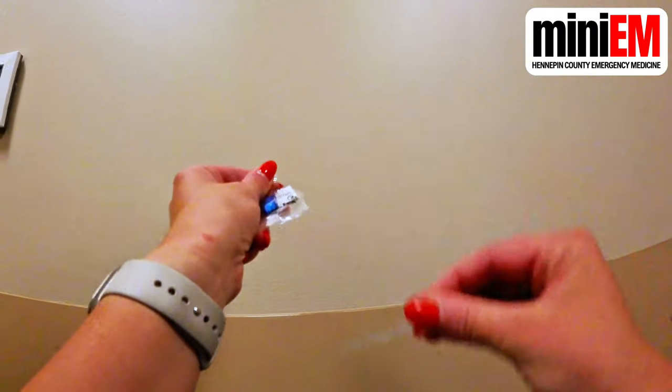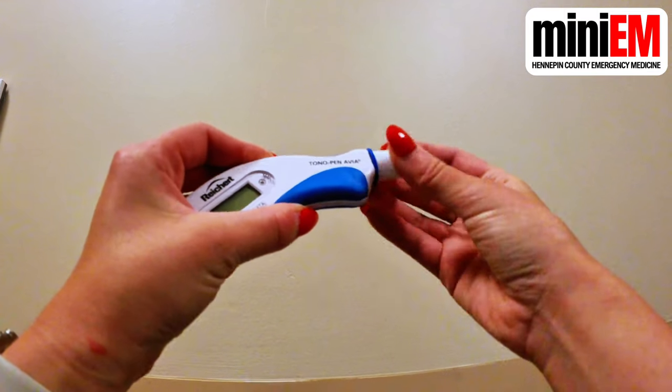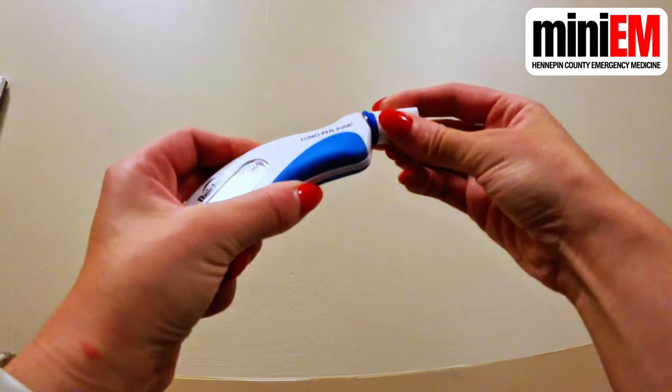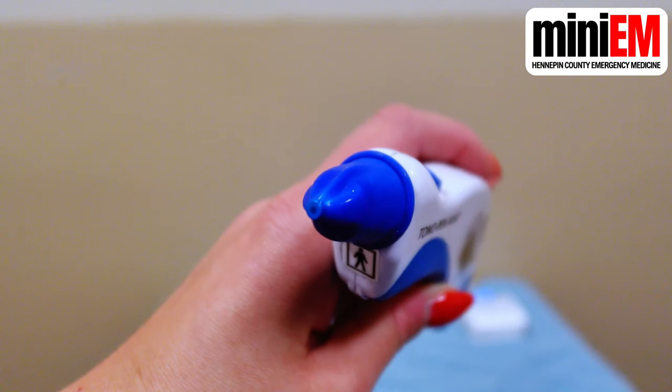Put the tono pen cover on, squeeze the paper, and push the blue plastic bit all the way down until it clicks into place. You want to see these little pleats in the tono pen cover — that's how you know it's not on too tight or too loose.